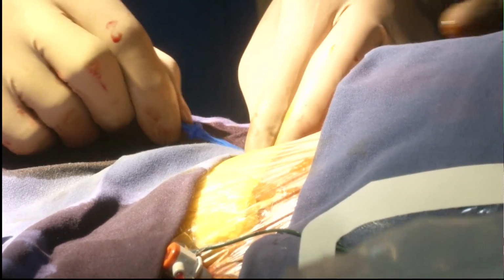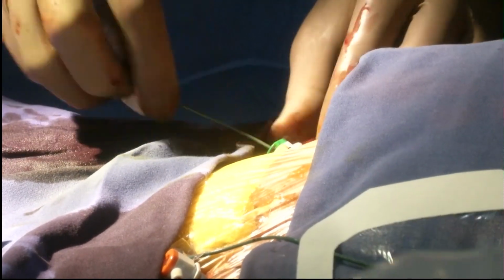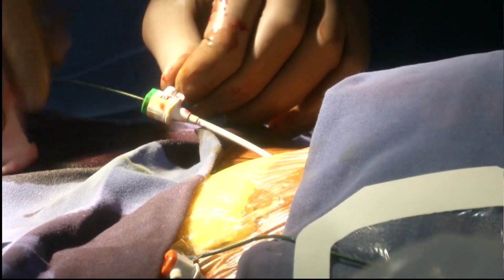But of course, echo-guided puncture is also very useful. And many people in the UK and in other countries, I don't know, Kantaro, if you moved to echo-guided puncture too? Yeah, we're doing the echo-guided. Echo-guided, okay. So I think it's a very, very good approach and very safe.